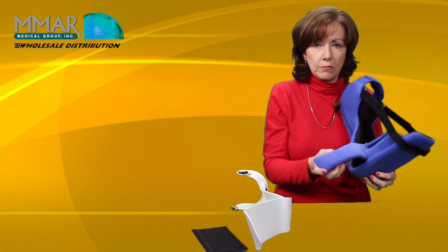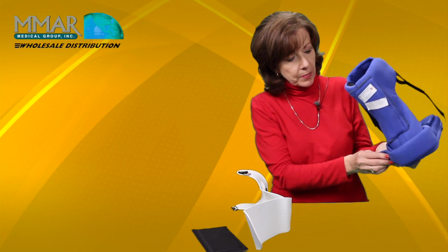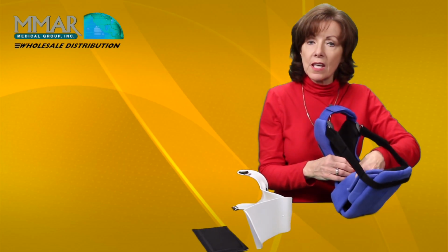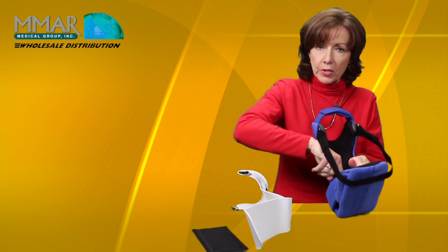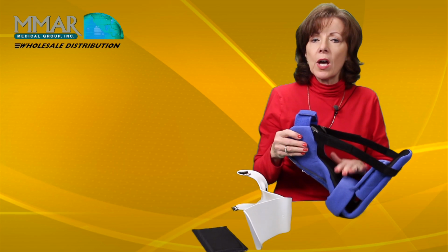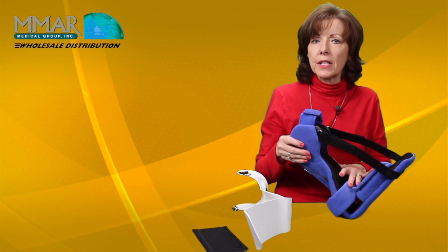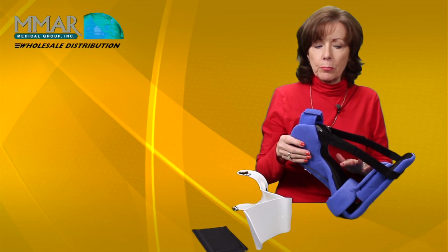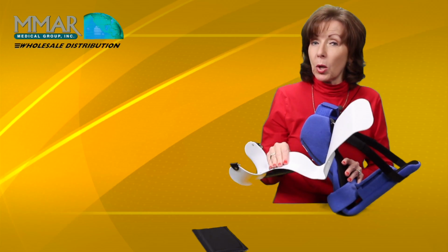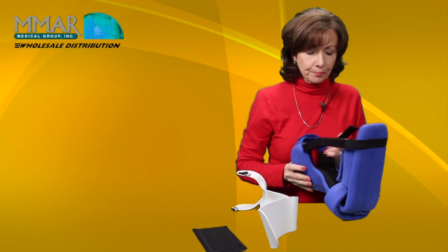The talus strap is the really important part to hold you into 90 degrees. And there's plenty of loop material to hook that to make sure it's snug, which again, you want to be able to run your finger under both sides of it. You do not want to put this tight enough that it causes any restriction of blood flow, any swelling, any problems like that. And part of the important part is if it needs to be molded, we're going to remold it. It all works together.